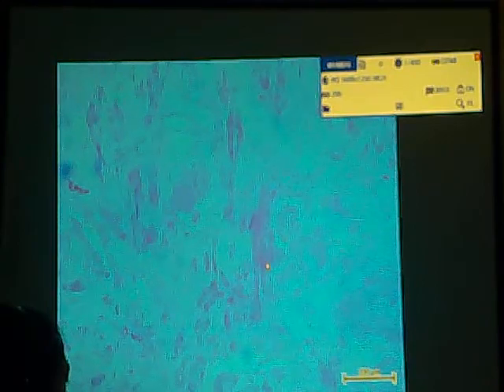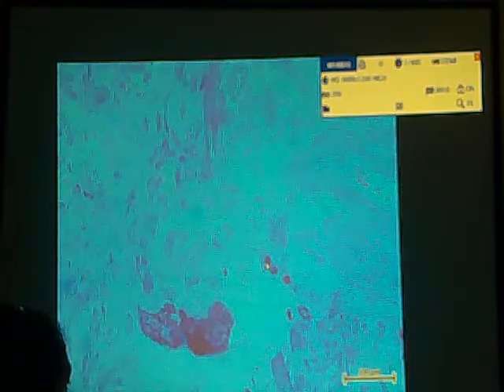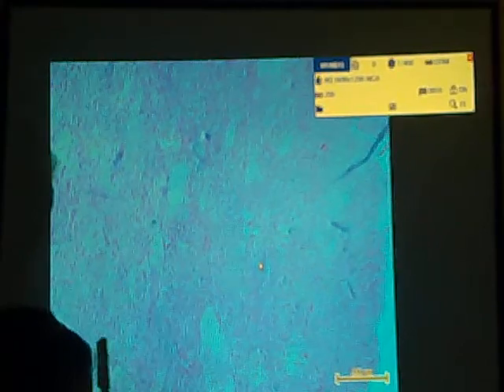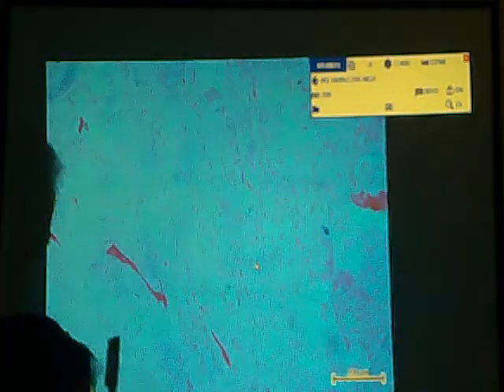So that will be your atrophic myocardium. Okay? So this is your amyloidosis. Organ, heart, or if I ask for the specific layer of the heart, myocardial. Special stain used to identify the presence of what substance?